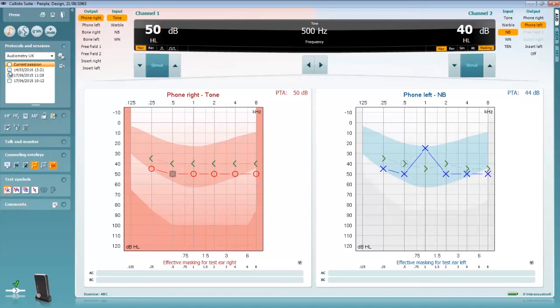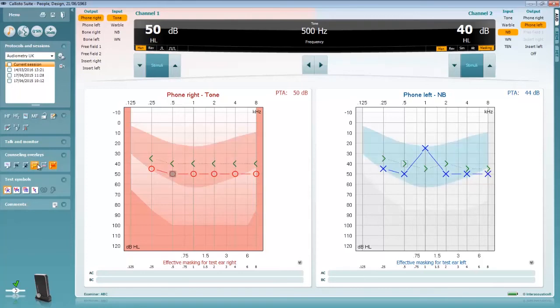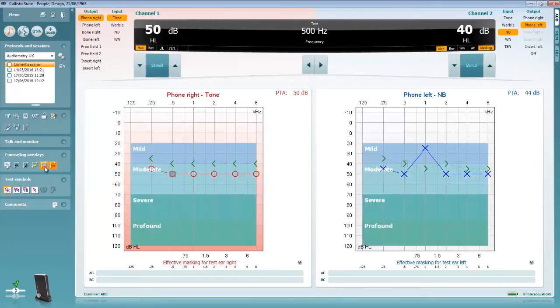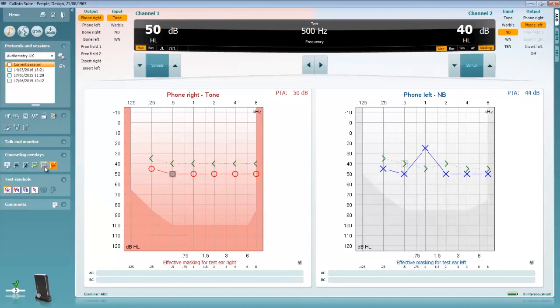When discussing the patient's hearing loss with them we've incorporated some counselling overlays to ease understanding. These can be accessed via the left toolbar. There are several overlays which display phonemes, sound examples, speech banana and severity.